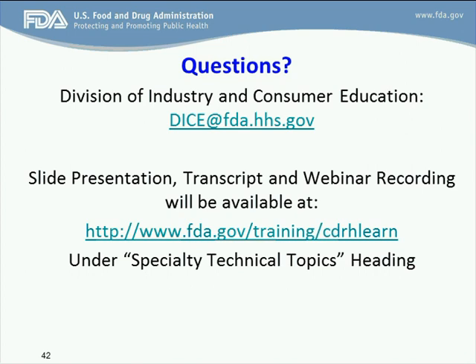And if you choose to use 3 markers or a very large number of samples, it's only going to strengthen your data and give you better, more valuable and more meaningful answers. Another element of that is how you choose those particular markers for the particular soils. It may vary depending upon what component they are, what percentage of the component they are in the actual clinical soil. But you may also need to evaluate the degree of strength that they adhere to the surfaces. Some of those components that you mentioned may be much more tightly binding to the surface and may be more of a problem for cleaning. So there's not a one answer fits all with these things, and that's why we, on a number of occasions, recommend that you contact the lead reviewing branch or division because they have a little bit better understanding of those particular device types.